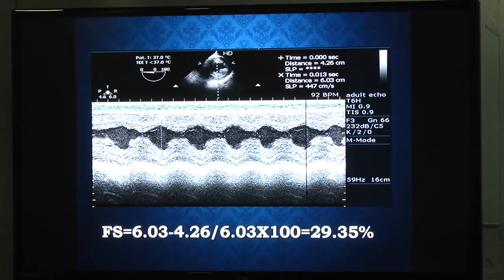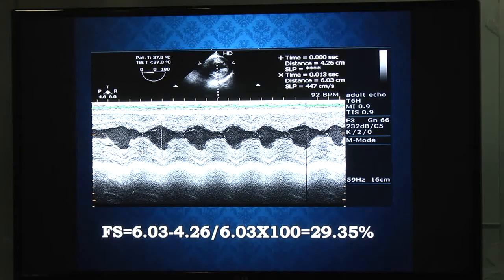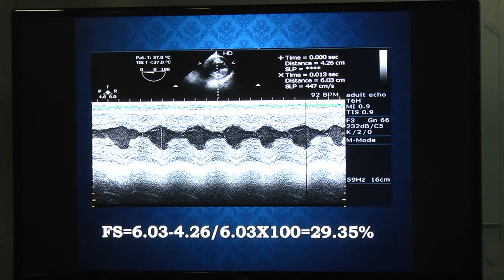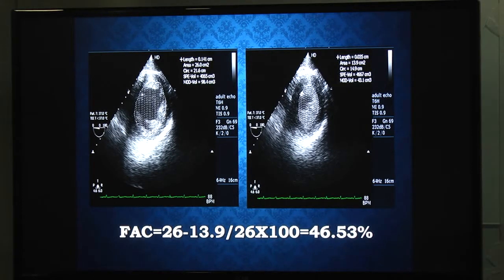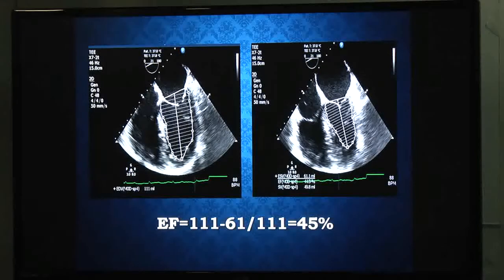An important consideration is to try to avoid papillary muscle inclusion in M-mode echocardiography. To avoid papillary inclusions, it is better to use the transgastric long axis view, in which we can visualize the papillary muscles and exclude them. Fractional area change is calculated in the transgastric short axis view of the LV, using the LV cavity area in diastole minus systole divided by diastolic area multiplied by 100.